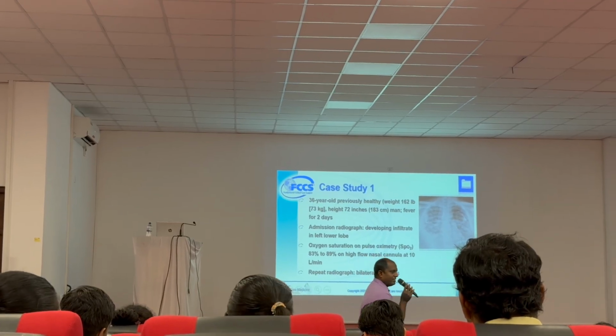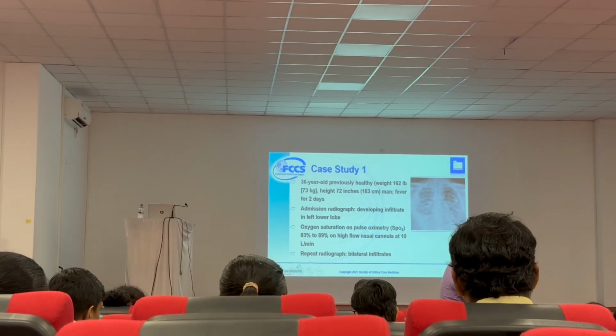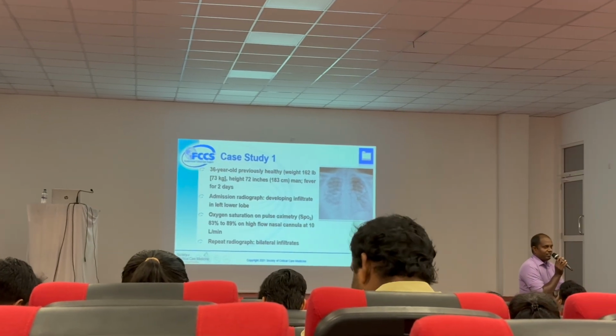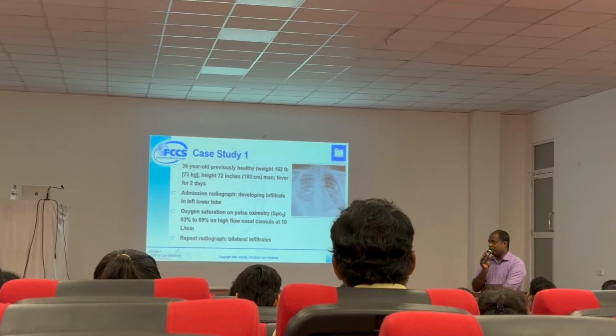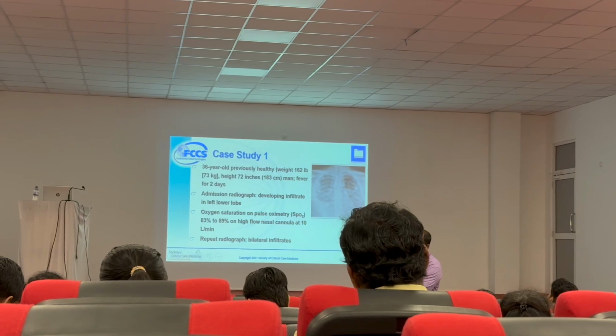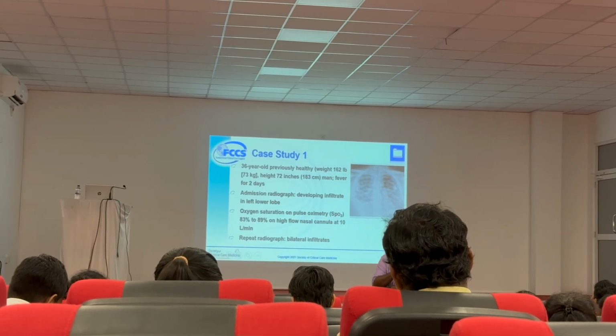Anyone? PEEP is a positive end expiratory pressure to keep the alveoli open throughout the respiratory cycle. So what is auto PEEP? She explained very well about the auto PEEP now.